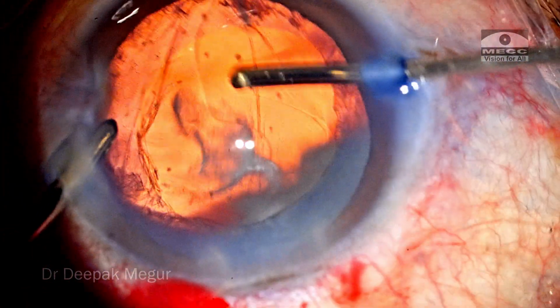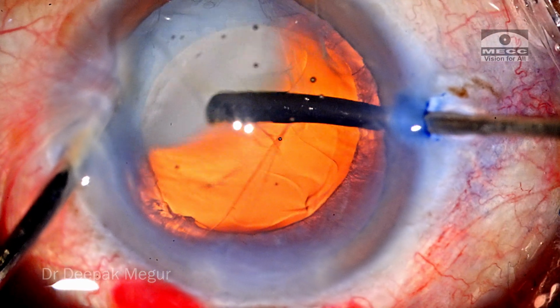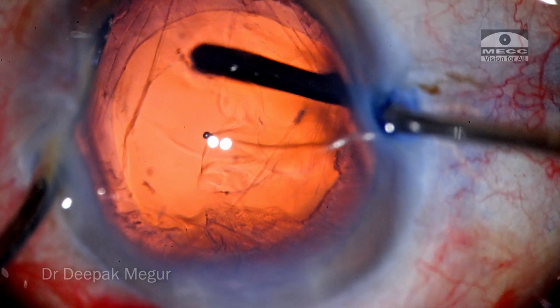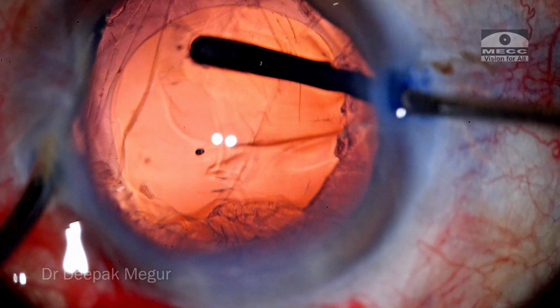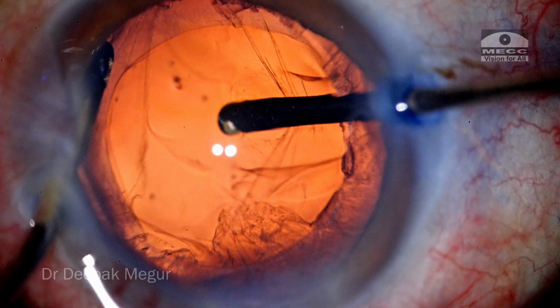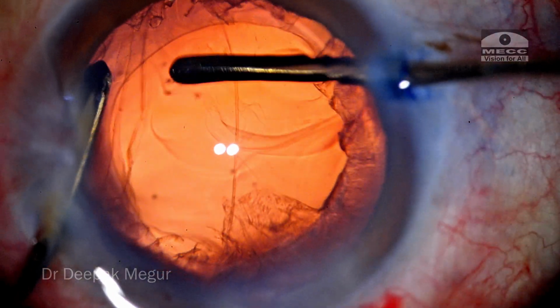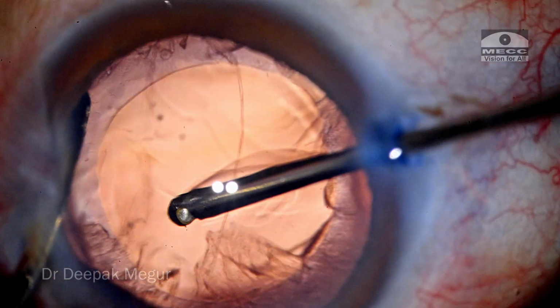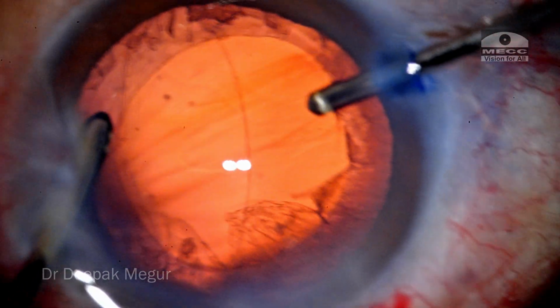The anterior vitrectomy is begun, and in just a couple of minutes the vitreous is taken care of. Now, looking at the edge of the posterior capsule gives an indication whether there is a vitreous strand which is traversing towards the incision. Because the posterior capsule tear edge on this side is pulling towards the incision, it's very obvious that the vitreous would be there, and in a matter of a few minutes, as the prolapsed vitreous is taken care of, you can see the shape of the edge of the posterior capsule tear changes. At this point, the prolapsed vitreous is taken care of. There's no evidence of vitreous.